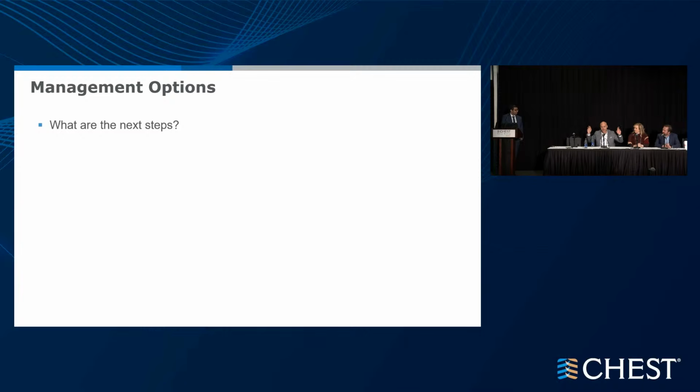We had an asthma attack after an EGD with esophageal stenting. Intubated, ICU, you go in and it's a virtual space. You need to take them emergently, put a wire and deploy a stent in the airway so they can actually breathe and ventilate. So the question that they had for you, I think, was very appropriate. Yes. Come and take a look at the airway. What do you think?